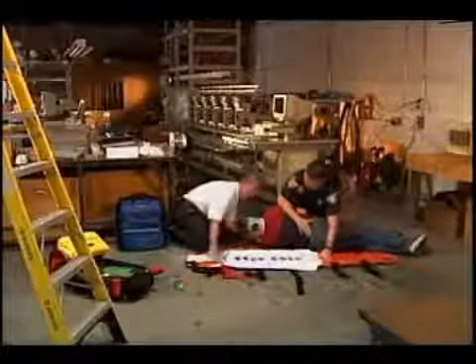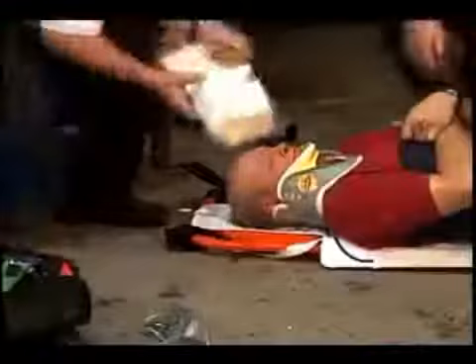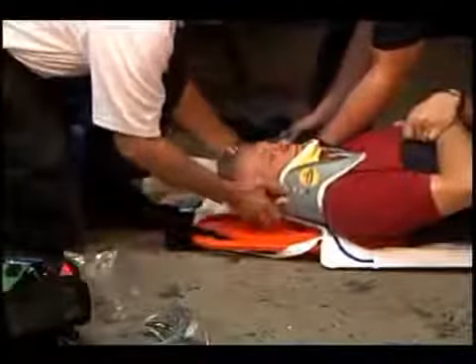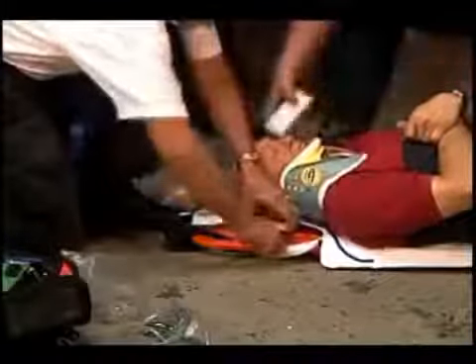You may elect to store the back raft on the backboard or keep it in the C-collar bag and apply it onto the backboard while on scene. Because the application of the back raft is simple and quick, either method is acceptable. The back raft should be deflated and secured to the board before positioning a patient onto it. To position the patient onto the back rafted backboard, follow your current spinal immobilization protocols. The back raft is designed to allow full function of the backboard and not interfere with your current patient packaging methods. Keep in mind, however, this is a tool, and you may need to assist the patient over the lower flap of the back raft in an extrication situation.